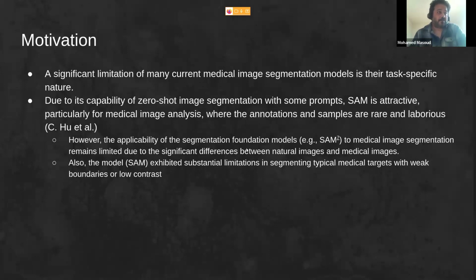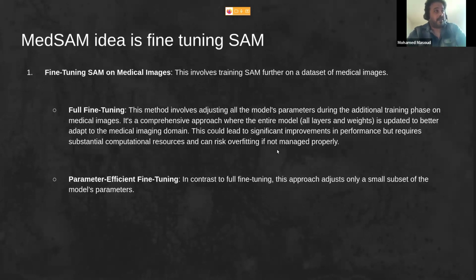So they came with this MedSAM idea as a fine-tune of the SAM model itself. They didn't change a lot on the original model here. They just trained almost the same model on medical data.